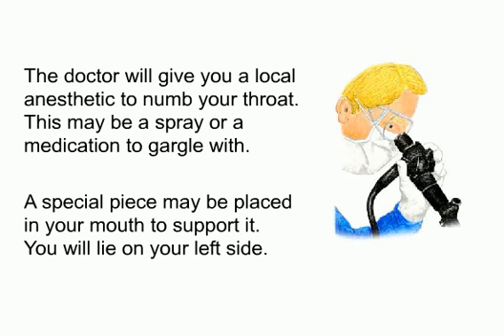Procedure. The doctor will give you a local anesthetic to numb your throat. This may be a spray or a medication to gargle with. A special piece may be placed in your mouth to support it. You will lie on your left side.